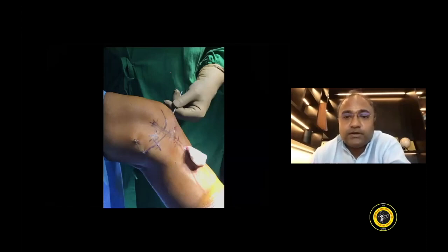A few tips and tricks for the same. I place the hook probe from the corresponding opposite portal, from the anterolateral portal. You can see the two portals that have been closed now. And the hook probe is pointing into the area where I need to get my needles out. And that is where I would take a safety incision.